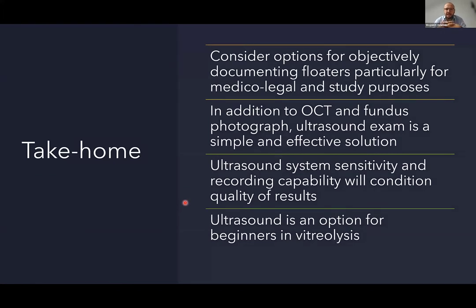So some take-home messages. We can obviously consider ultrasound as a tool in the diagnostic process, as well as a documentation tool for patients with floaters. However, we have to remember some of the downsides. But together with OCT, together with fundus photography, it might be an effective solution.